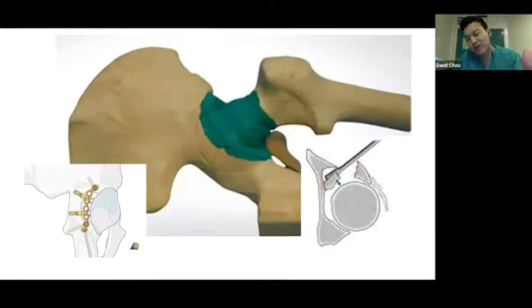So you've got the green rubbery thing on this model, which represents the capsule. And behind this, you can see the fracture lines here and here of the posterior wall. And so what you don't want to do is to incise that capsule. You want to keep that capsule completely intact, but to open up the fracture from the posterior of the posterior wall. And so you can see on this image on the right, we've managed to get a periosteal elevator into the fracture and affect the marginal depression of the acetabular fracture by going through the fracture.